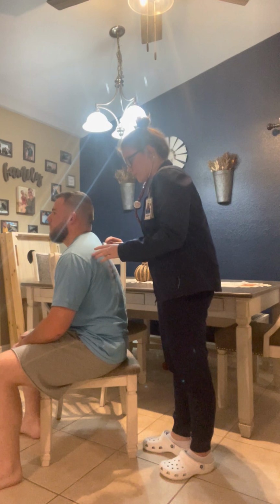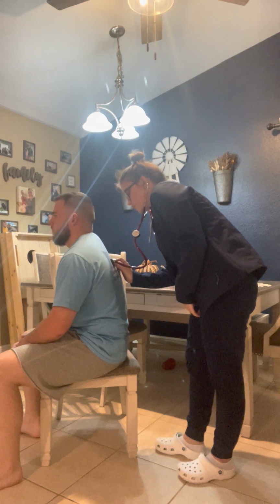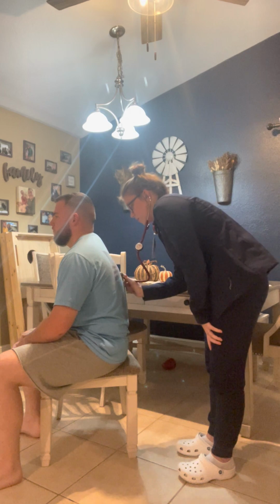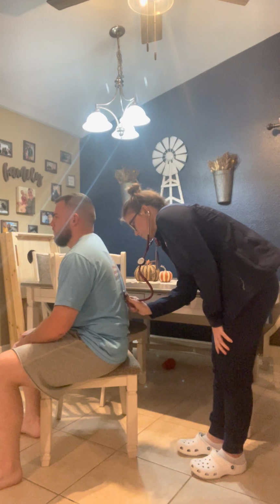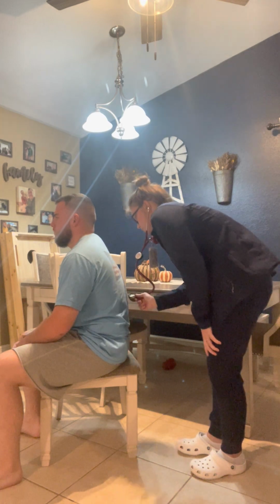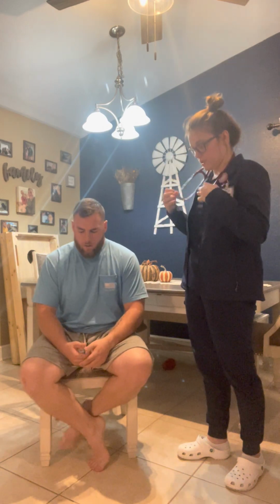Okay, every time you feel my stethoscope move, just take a deep breath for me. You want to make sure you're not listening over the scapula. You want to make sure you're listening on the insides. Again, comparing both sides as you go across. So a lot of times people will just go side to side, so that way they're comparing the same spots. Again, you want to go all the way down and all the way over to the axillary side. Make sure you're reaching all parts of the lobe. Okay, you can turn back around. Again, I don't hear any adventitious sounds. Everything sounds clear at this point.